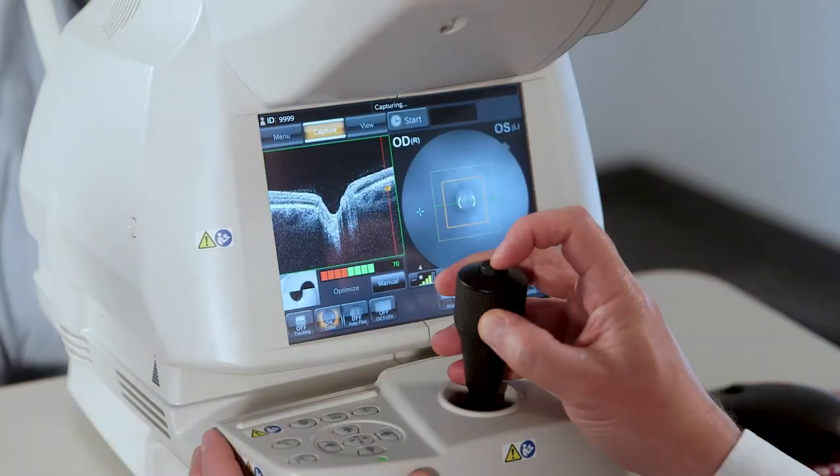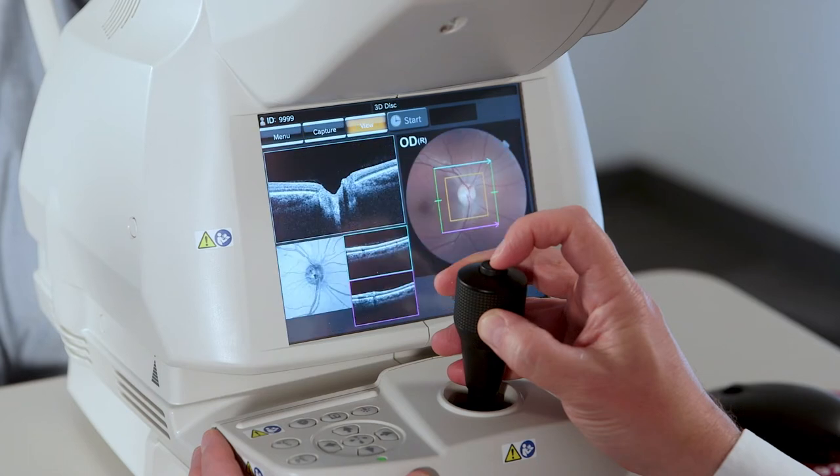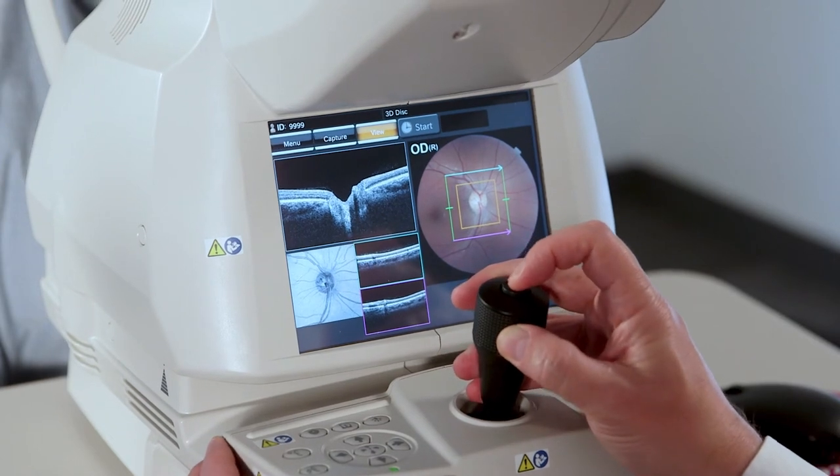After the scan is done, we check for blinks, fundus photo quality, and signal strength. If all looks good, we proceed to the next eye. To return to capture, we simply hit the joystick button again.